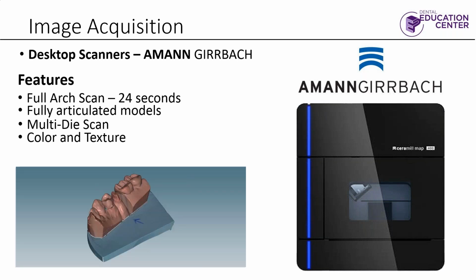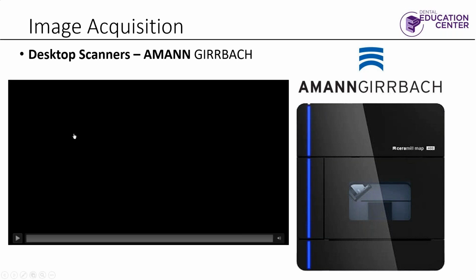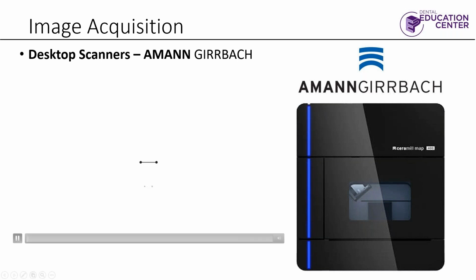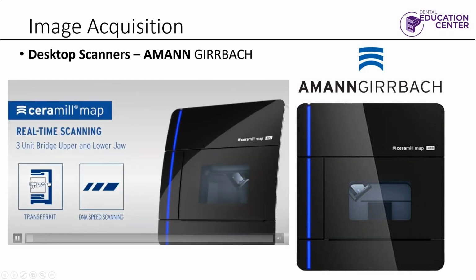Obviously, color and texture. You can see you can draw an arrow on it and actually pay attention to what you're scanning. The accuracy, strip light, open STL, also will do impressions. I am going to play some manufacturers' videos, but some of these are very relevant, and I think they're actually good for education. This first one is going to just give you a feel of what it takes to actually do a scan from beginning to end.